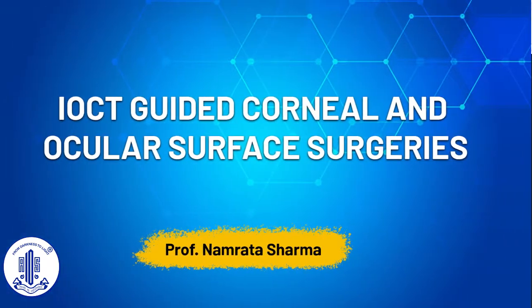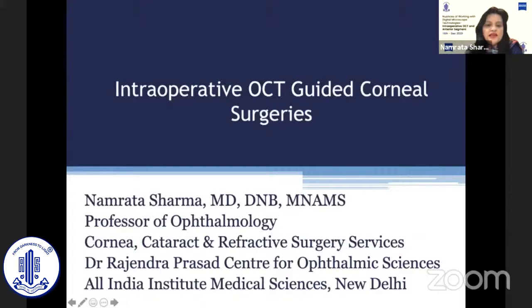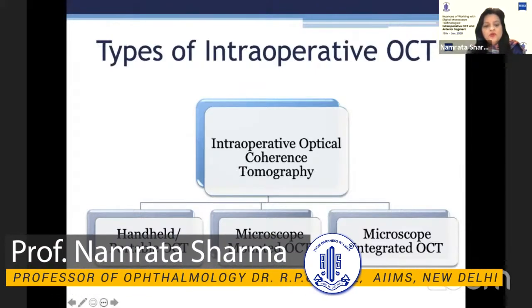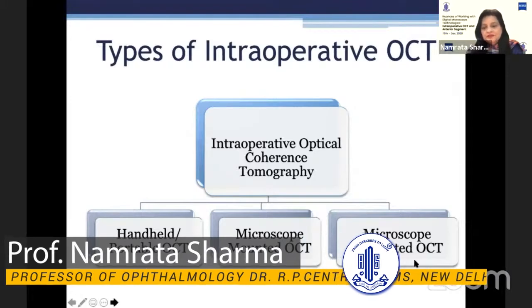OCT guided corneal and anterior segment surgeries, and we've become so used to it that it now becomes difficult to operate without having one, especially the corneal and the ocular surface surgeries. Now, the intraoperative OCT is available with various options, but I'll be talking to you about the microscope integrated OCT.